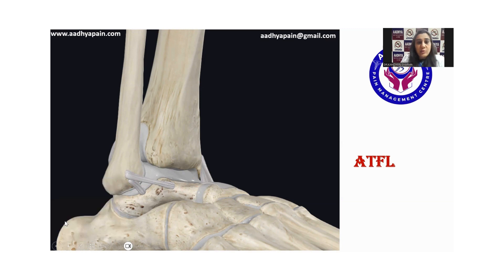Now I'll teach you a very simple technique to identify this ligament in one go. First of all, we will be palpating the lateral malleolus, and everything I'm going to show you here, we will have a look at in the demonstration video.